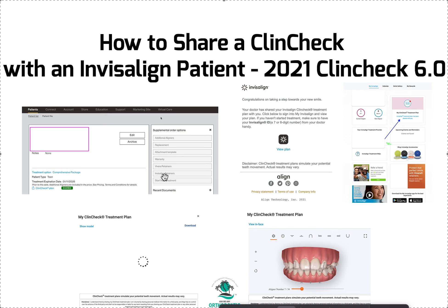The doctor is going to go into the patient's ClinCheck. Up here on the top left it's going to say something like 'Share ClinCheck,' and it's shared — it has a checkmark. There it is — 'ClinCheck plan shared.' You just click that button and that starts the process of sharing the ClinCheck.